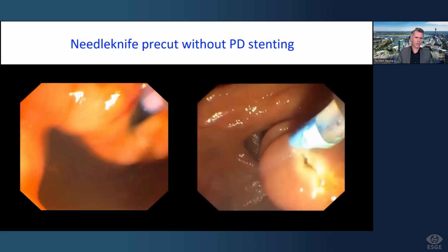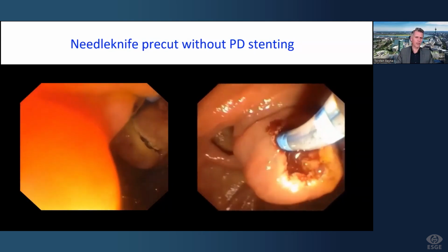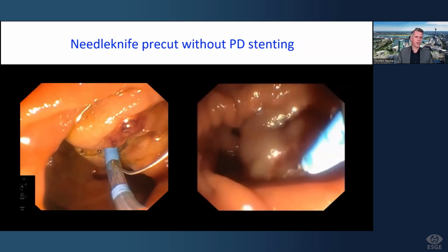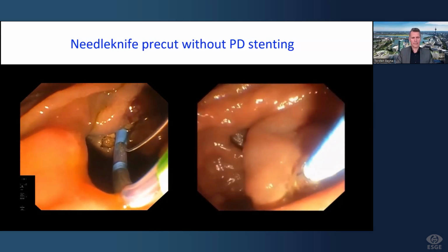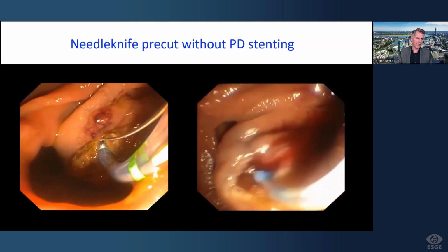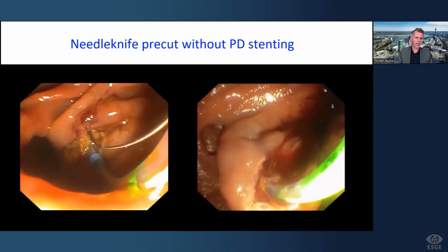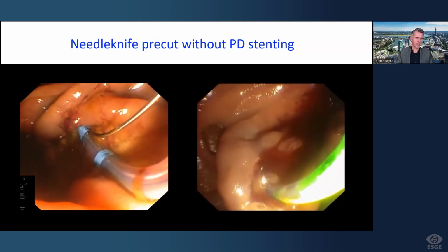Be careful where to cut. But if you see this bulging of the CBD over the papilla, you can also go for needle knife precut sometimes, and this is also in the literature the so-called fistulotomy. If you come from above, it seems to be even safer. You can do that as well, but I believe in needle knife starting from the orifice, and then you can use here the sphincterotome on the left-hand side, and then you have a pancreatic wire in place. You can do here a transpancreatic extension of the sphincterotomy, and then after that, here it was possible to put in a biliary guide wire.